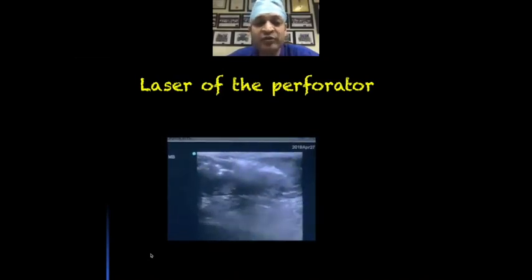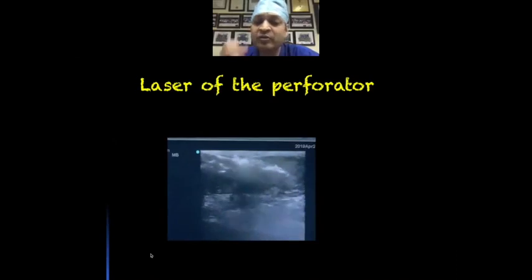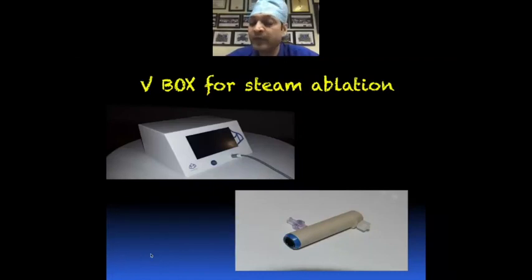So we have closed very big perforators, around 2 centimeter perforators, with this. But I still remember a very big mid-thigh perforator which we closed with a laser. It opened up 6 weeks later, and so it's not like you will get 100% results, but yes, more than 90% of the perforators can be very easily closed with a laser and the foam.